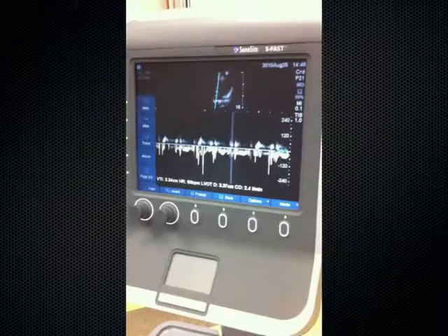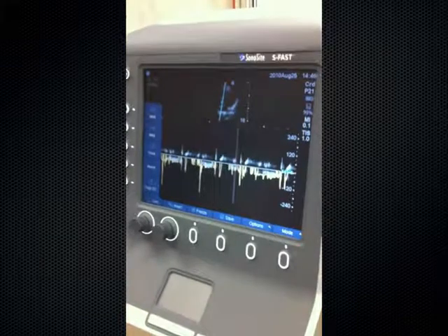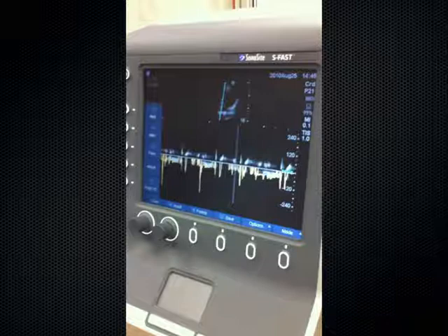Yes? So you have parabolic flow coming out, so when you do the gating, how large can you take the gate? Because depending where you are, you're going to have completely skewed results. Yeah, so there's a sampling gate that you can make wider or skinnier, okay? That's a good question. I've been messing with that sampling gate. What he's asking about, that little TIE fighter, you can spread out its wings, if you will, further apart or more narrow, and that changes your waveform quite a bit. So that's something we got to mess around with. I'm not sure. This is all brand new stuff, so I don't know the exact answer to your question.